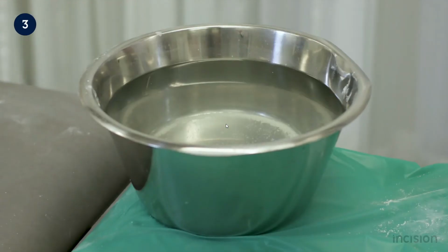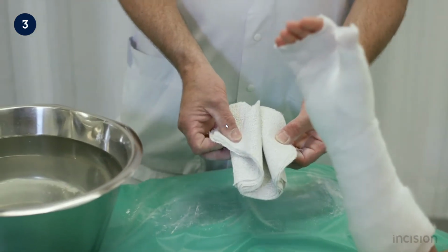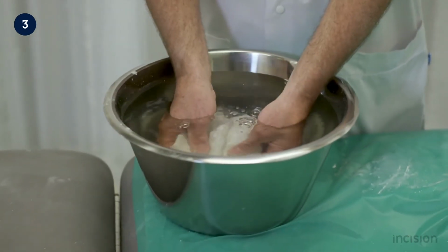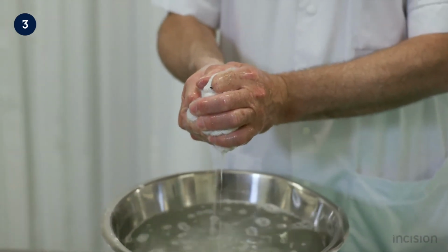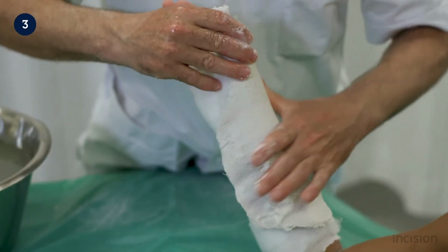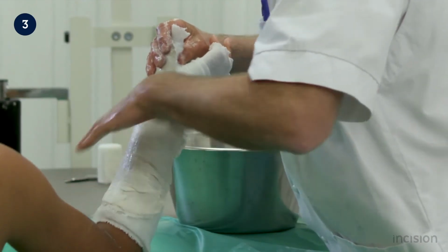Water at room temperature is used, as too hot water causes the plaster to harden too quickly. The plaster is folded in a corrugated fashion. Care should be taken not to hold the plaster in the water for too long. The plaster is squeezed to get rid of excess water. It is applied to the arm and smoothened so any wrinkles are removed and the water is distributed evenly throughout the plaster.